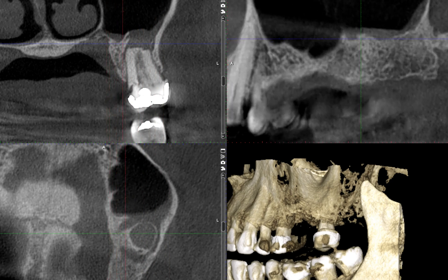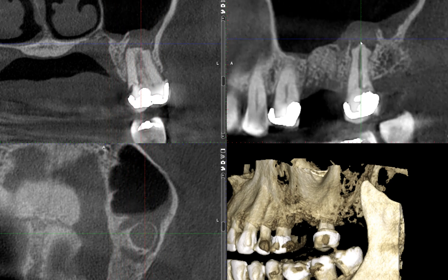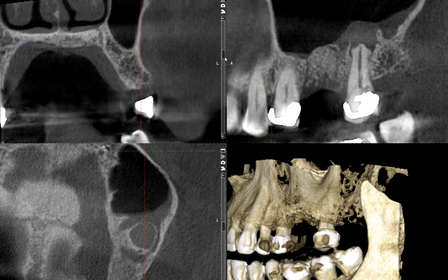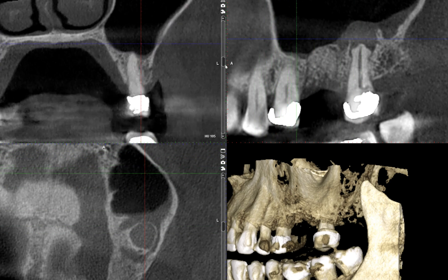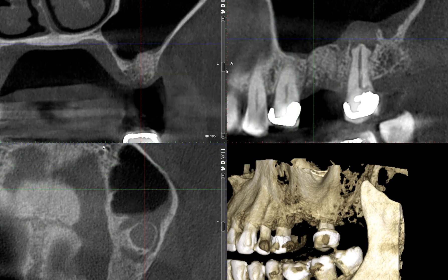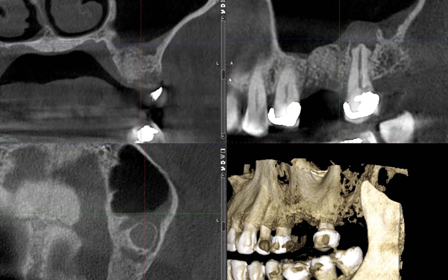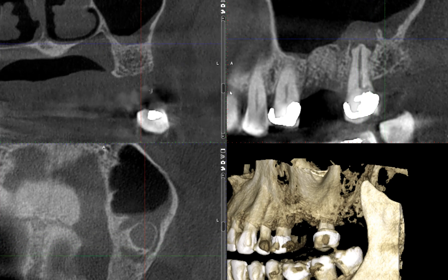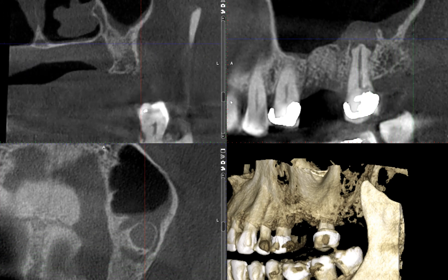If you evaluate the entire floor of the maxillary sinus, that thickening is predominantly over this area — not so much in this part of the sinus. Looking at the coronal section, the sinus is clear here, and as you go toward the tooth, there's increased thickening of the sinus lining.